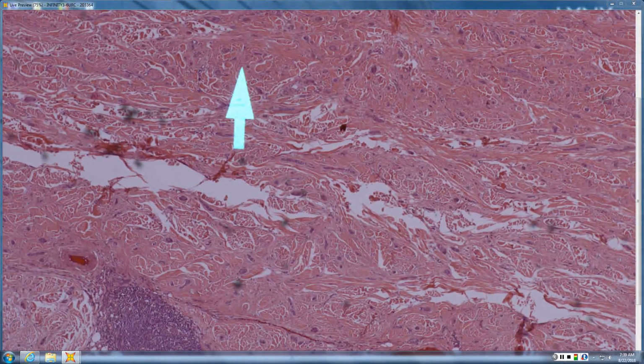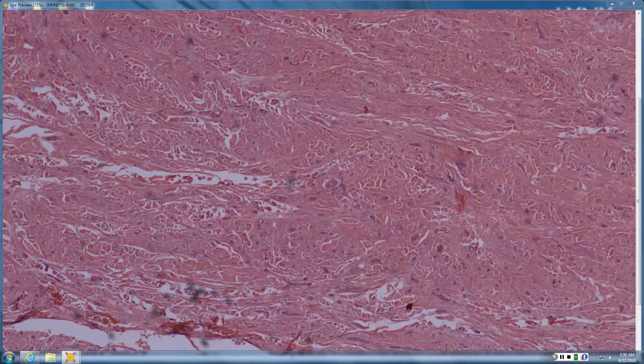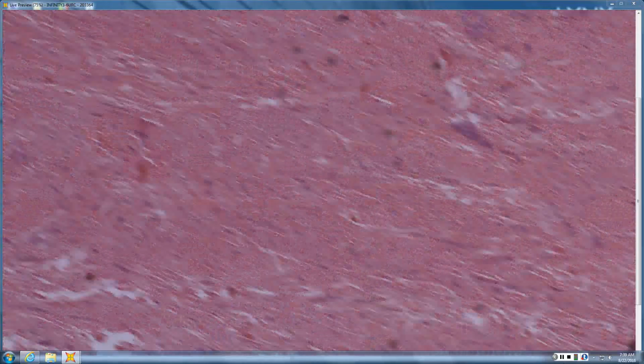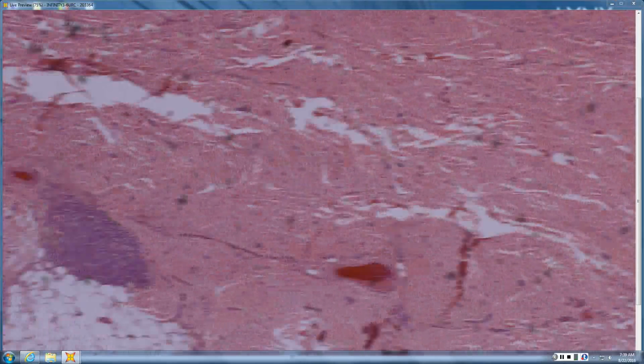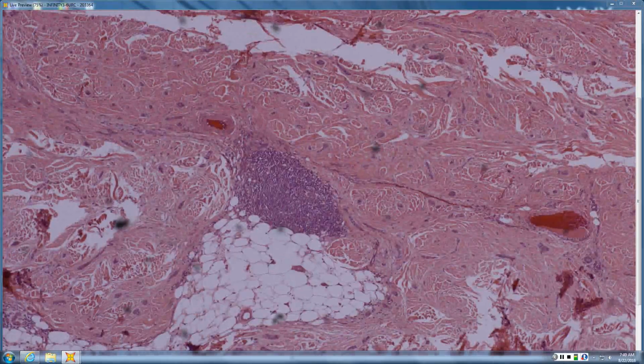So a purely sweaty MAC is the sclerosing sweat duct carcinoma. So it's a type of microcystic adnexal carcinoma. Like other MACs, it can have paisley tie. Unlike other MACs, it doesn't have blue islands. It only has pink islands that are kind of tadpole-like, but they show perineural invasion, they have deep extension, and are associated often with nodular lymphoid aggregates. Okay. So sclerosing sweat duct carcinoma, some people just refer to it as a sweaty MAC.